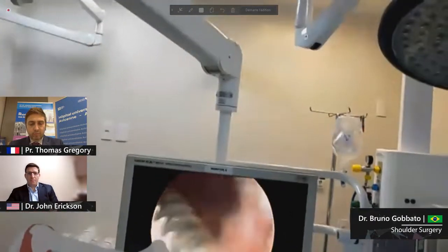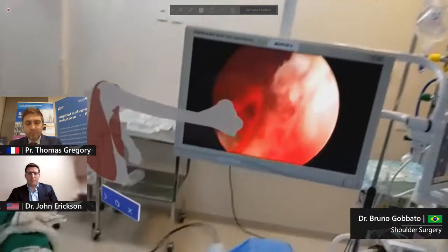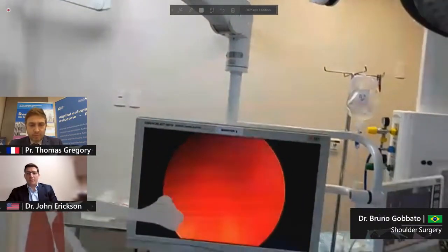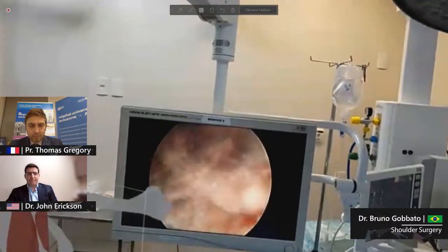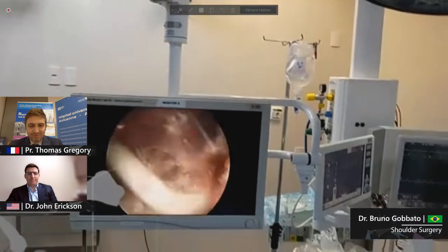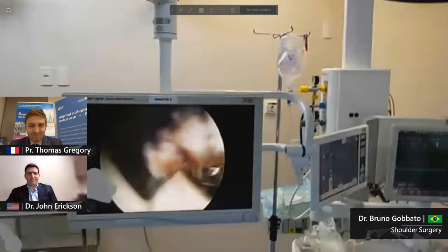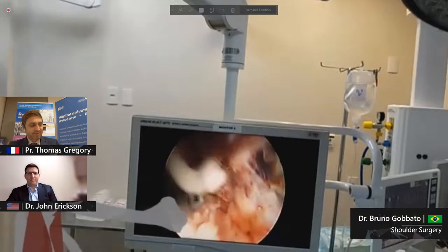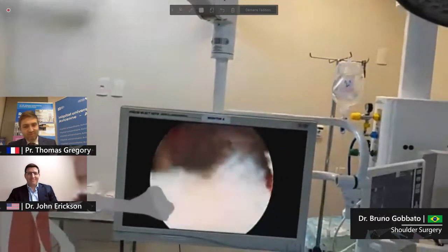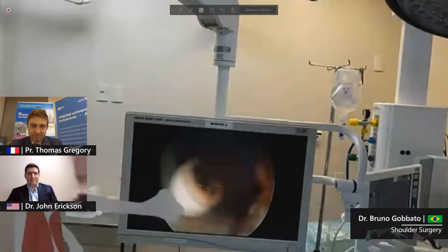We are still discovering it, and I'm very thankful to Thomas for this opportunity to use this kind of device and test it and maybe push the limits a little bit forward. And I'm very thankful to be here with you guys today. It's been an amazing opportunity. Thank you, Microsoft. Thank you, Jonathan from Evolitis also. He's always there for us, and I hope we still connect and share our surgeries.